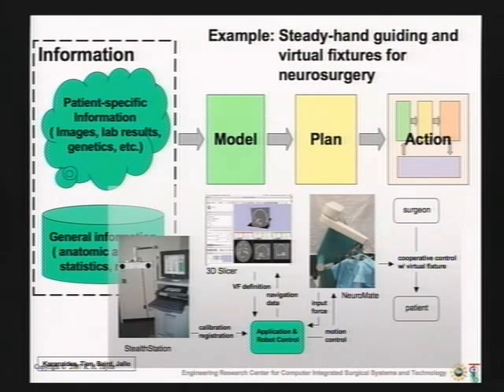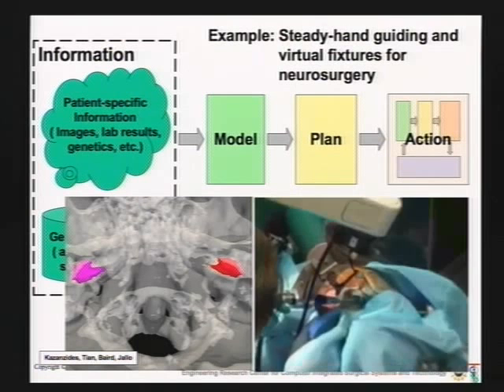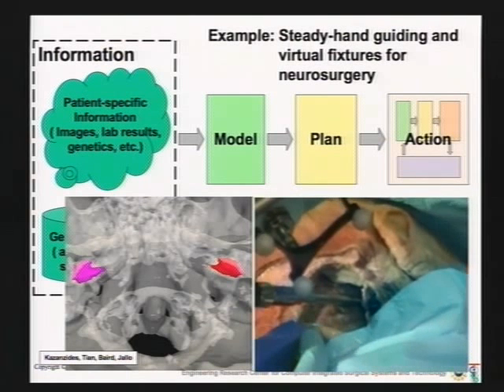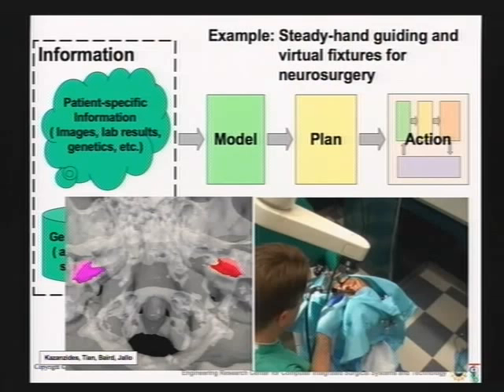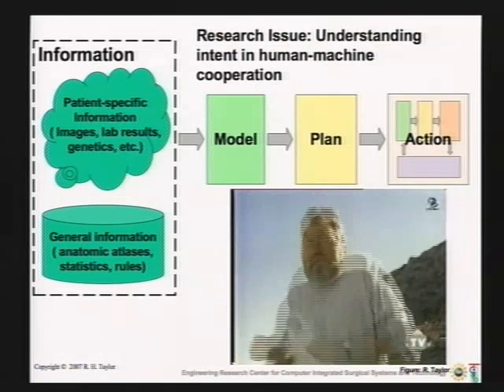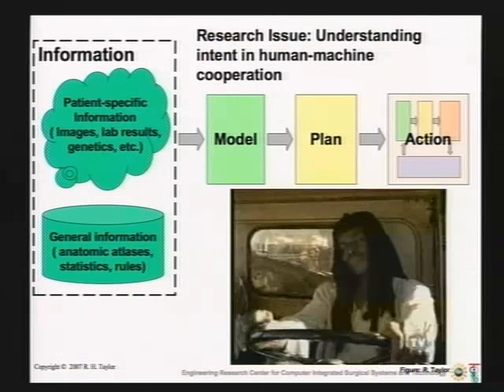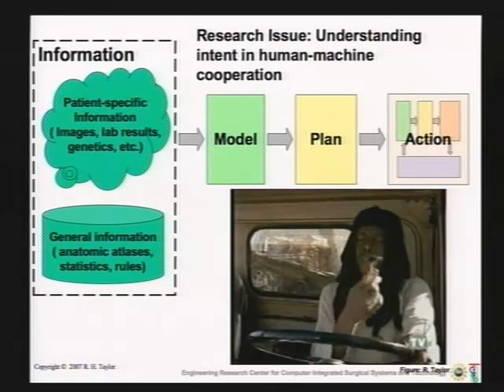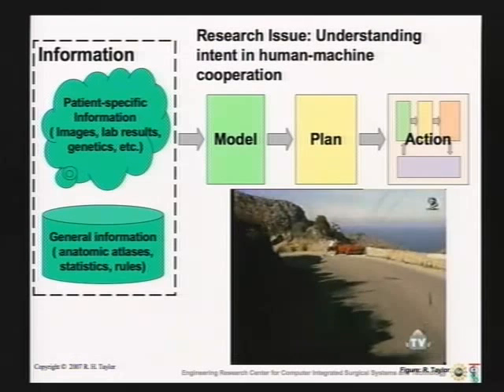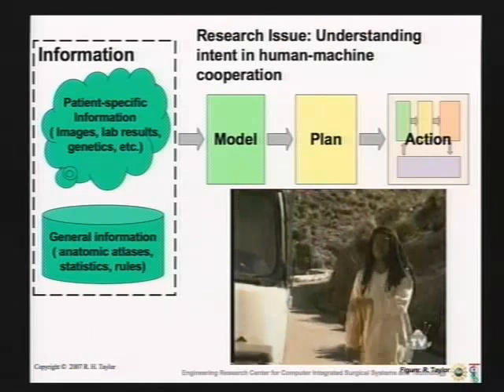One other example, here is again that acoustic neuroma example. We've put together a system where again it's this hand-over-hand control, and this is a neurosurgery resident, and he's milling out that cavity. I want to make a point here, and then I'm going to have to really speed up. Here's our surgical robot, or I'm sorry, this is our surgeon. He's working really hard. Here is the surgical robot, and in a moment you're going to see the robot actually gives the surgeon superhuman capabilities. So the robot is going to help the surgeon.